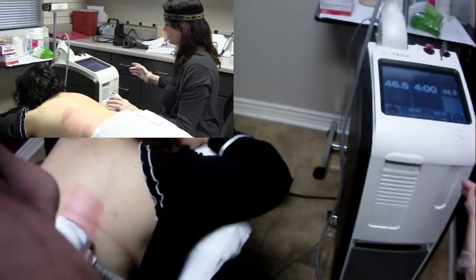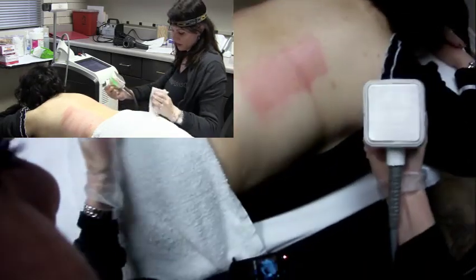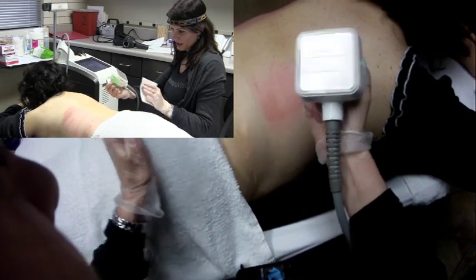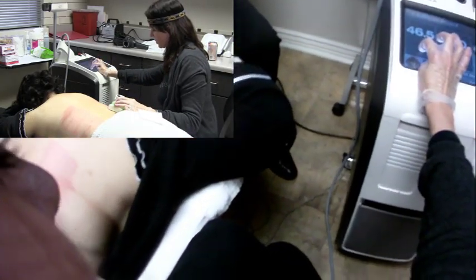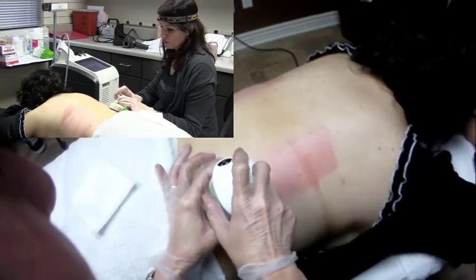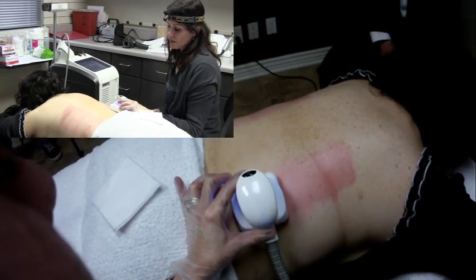One second — I need to dab off the area and then dab off the probe. This is what it looks like — it gets a little bit of sweat on it. I'm going to replace it and I'm going to drop my temperature down.